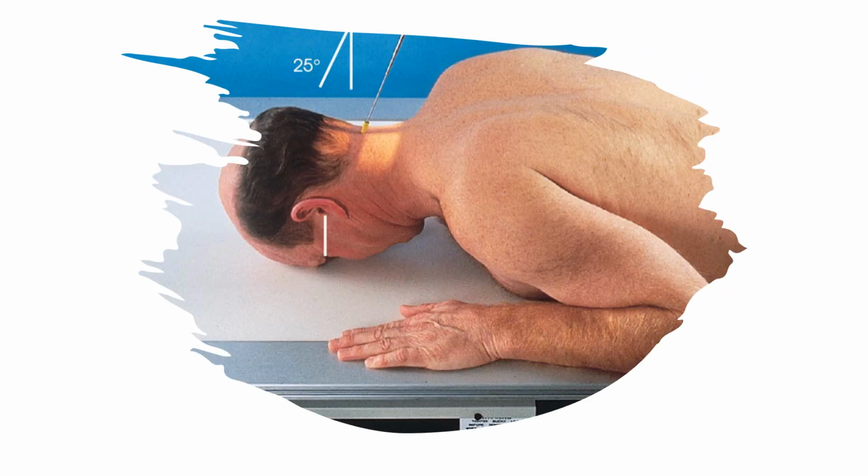Haas projection. This is, of course, the prone version. You can do it standing up. Orbital meatal line perpendicular to your image receptor or your table surface. And then your central ray is directed to a 25-degree cephalad angle this time that passes through the EAMs on each side. You see how that works? So it's not exactly the same center either. Okay. So again, 25-degree cephalad angle toward the head.